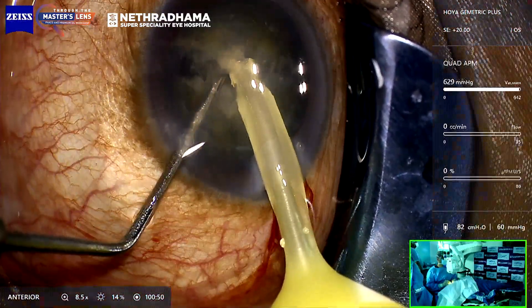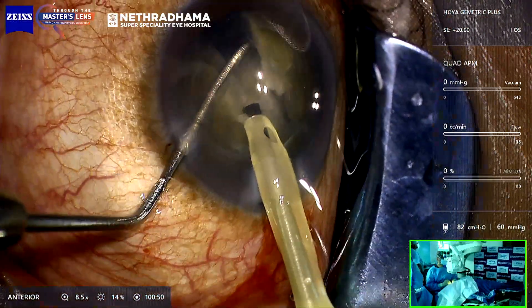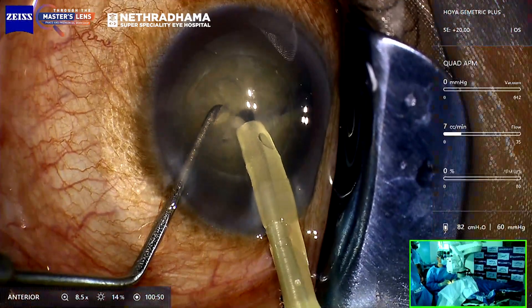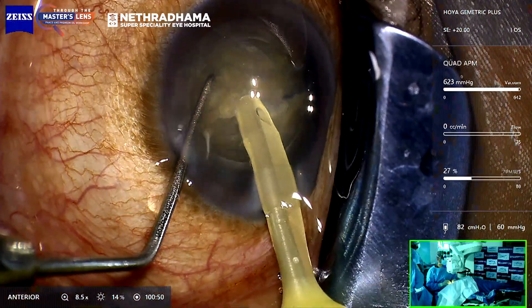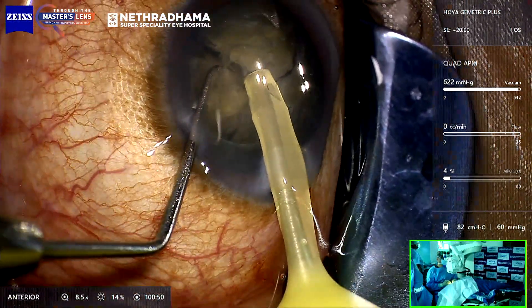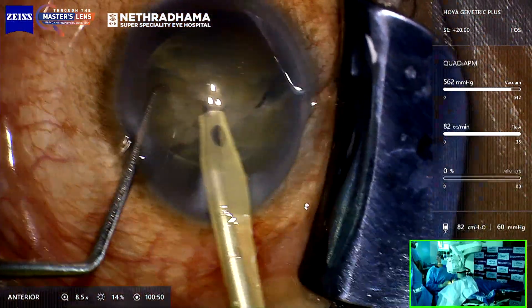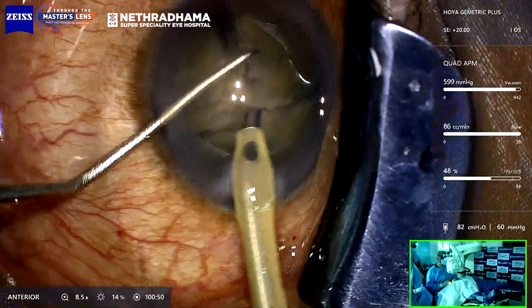You can see I'm at the peak of vacuum — 600 and 629 — because Bangalore has a higher altitude, it doesn't go to 700 vacuum even if you set it. We all know that vacuum depends upon atmospheric pressure and altitude. Rotate again, bury, chop. Then I just bring it to the safe zone, which is the center.